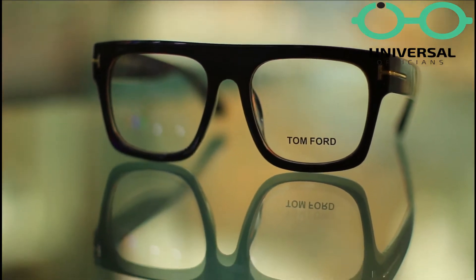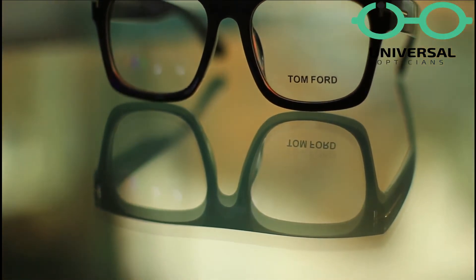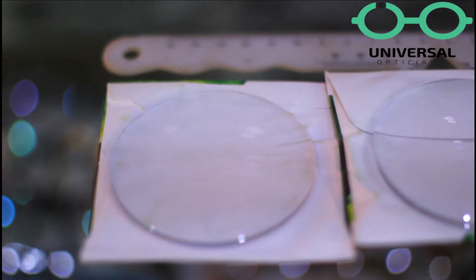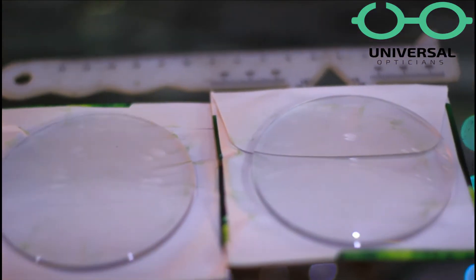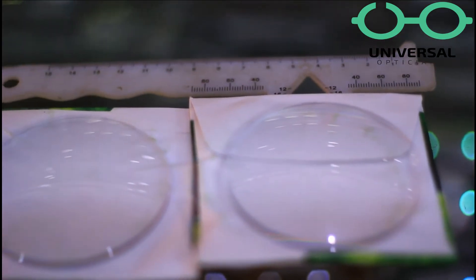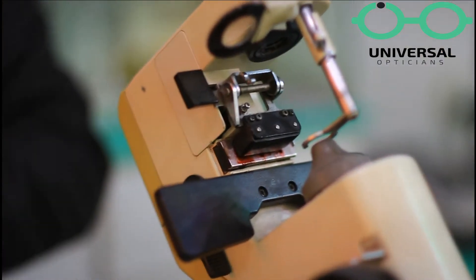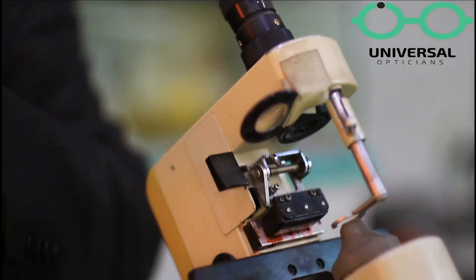So let's start. The glasses lab is ready. This is a complete transparent glass in plastic. Now we will measure the intra pupil distance and frame sizes and dimensions, and accordingly we are ready for fitting our frame glasses.